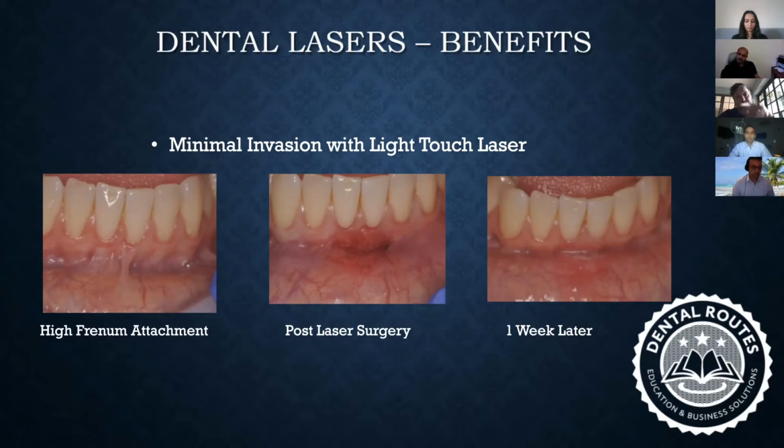Was there any anesthetic given at the time? With her, I did give her a tiny bit of anesthetic, yes, but it depends. Sometimes you can be a bit heroic and say, I want to try without any anesthetic at all. And for me, you need very less anesthesia. I'll show you a next case where I don't even give an anesthesia, but when you're doing surgeries, it's better to try to give a tiny bit, so it's a bit of peace of mind, unless the patient is so phobic about anesthesia. I did give a tiny bit here, okay?